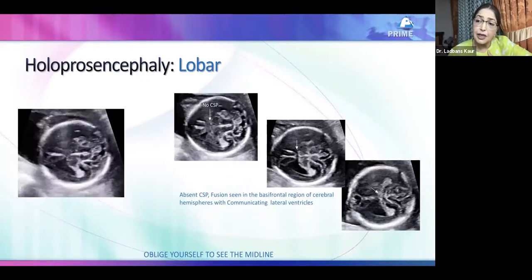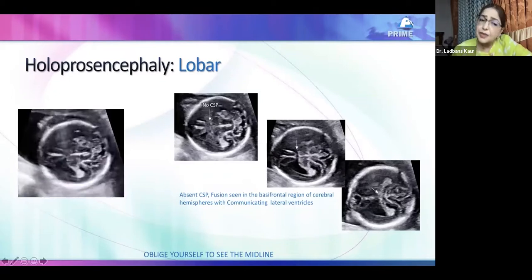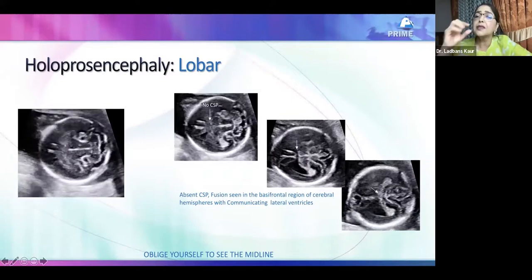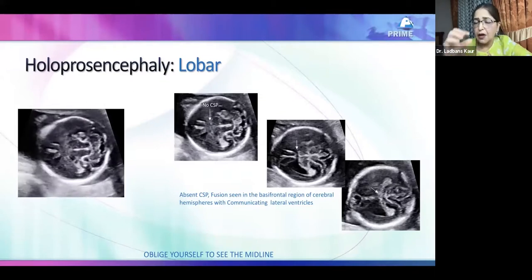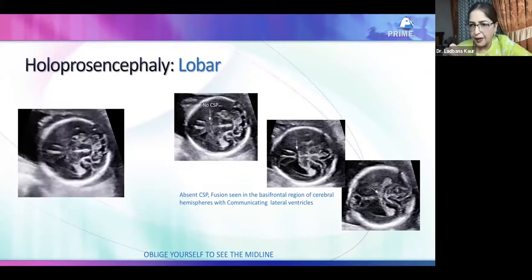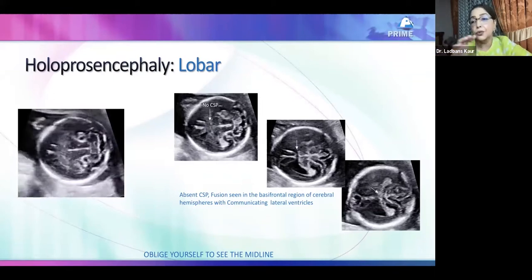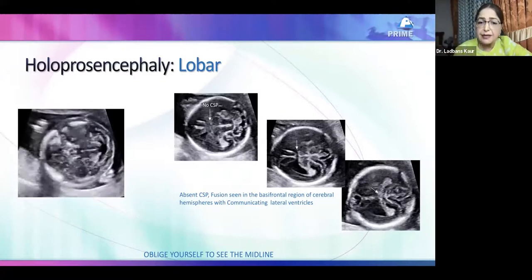More challenging. Let me tell you, this is at 16 weeks I'm seeing. This is what is called lobar holoprosencephaly. There is absent CSP. I've taken still images from this particular video showing you no CSP. So concentrate on that box. It's seen interrupting the anterior one third of the interhemispheric fissure. Try to concentrate in every scan dedicatedly at the transventricular plane. Your transventricular plane has to be perfect. It has to be horizontal. You cannot have oblique planes and try to visualize that particular structure. Wait for the baby. Be patient. It'll come. And that is absent.